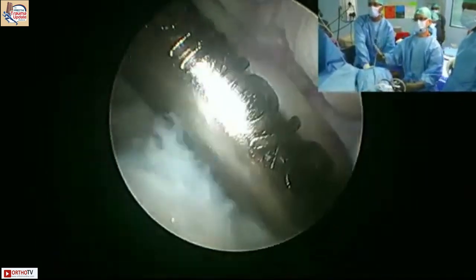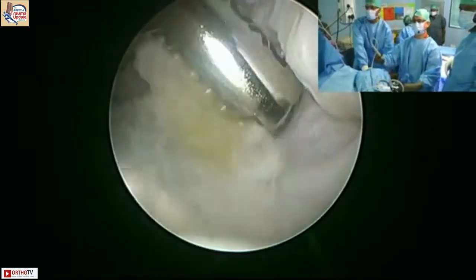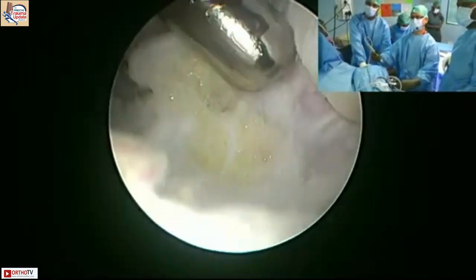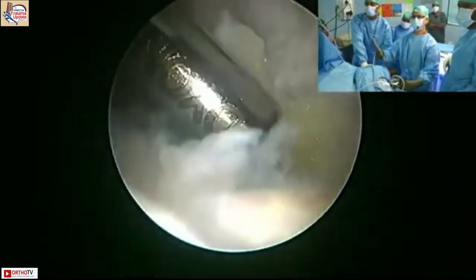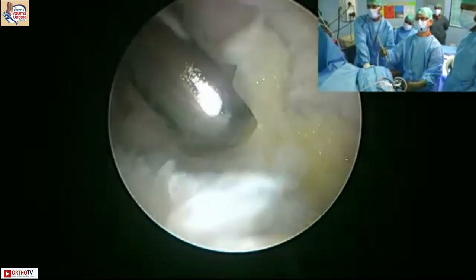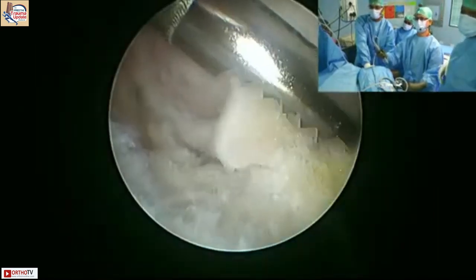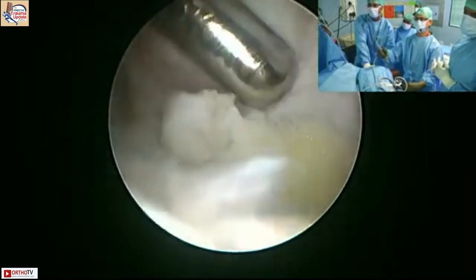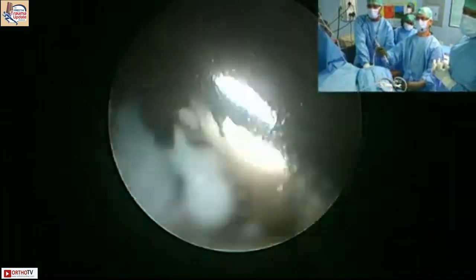Proximity, I mean, especially the wrist, we are worried about the cartilage, which are all so closely packed, and the intrinsic ligaments also. Elbow, yes, to a certain extent. Is it isolated ulna or is it just gone with that? So, anteromedial portal, yeah. Okay. So it's taken a little while, but we've managed to eat it up, most of it. And you will find these bodies are reasonably soft.